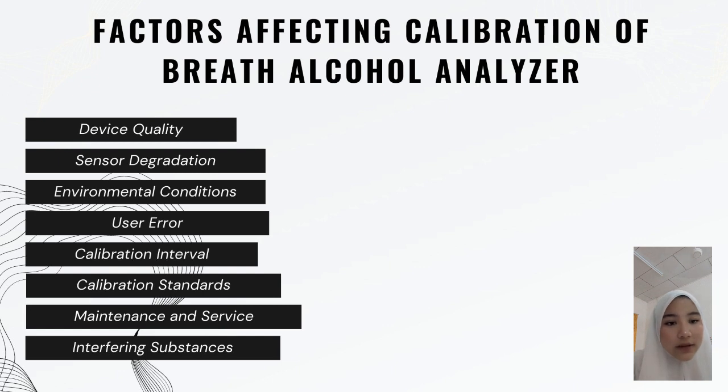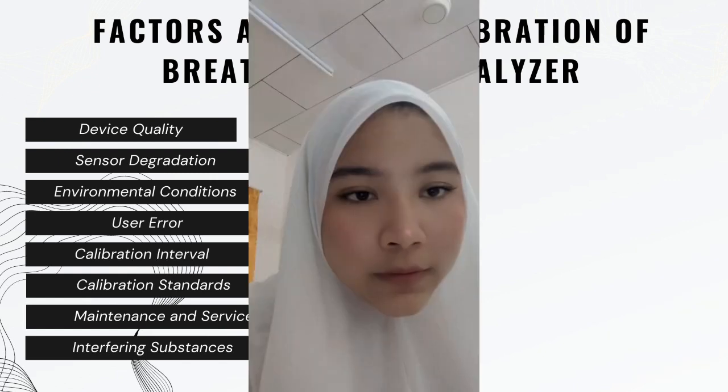Next is user error. Calibration requires proper technique and adherence to the manufacturer's instructions. Failure to follow the recommended calibration procedure or incorrect handling of the device during the calibration process can introduce errors and affect the calibration accuracy.